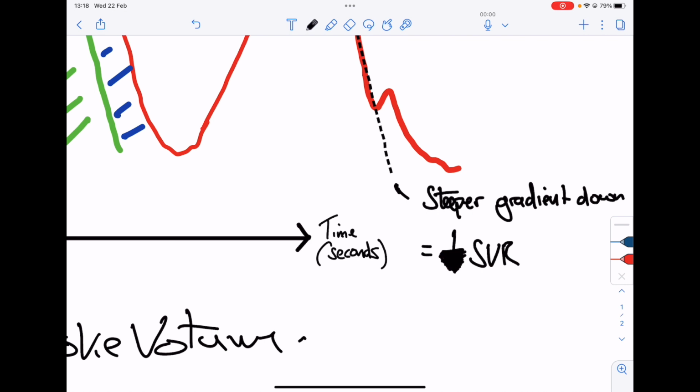So that pressure wave that the aorta keeps going, the Windkessel effect, that elasticity, the aorta isn't as stretched as much because it's flaccid. The rest of your arterial vasculature might be more flaccid, subsequently meaning that the stroke volume is dumped into the aorta with little change in shape. We'll talk a little bit more about systemic vascular resistance in the arterial line waveform trace in a moment.